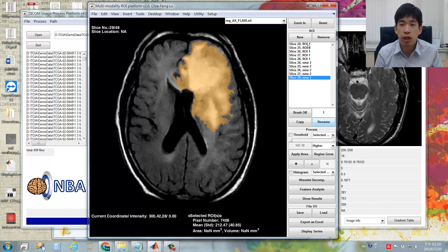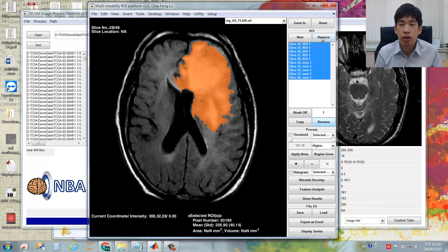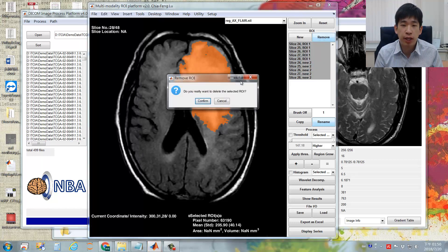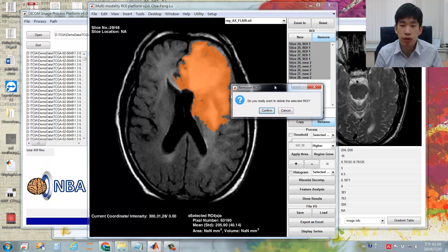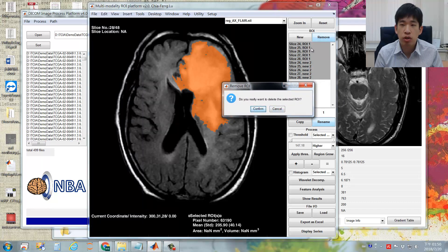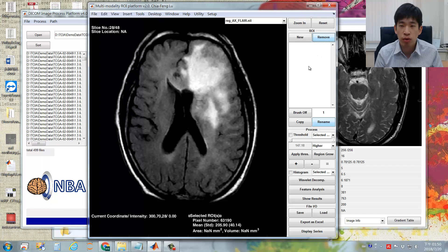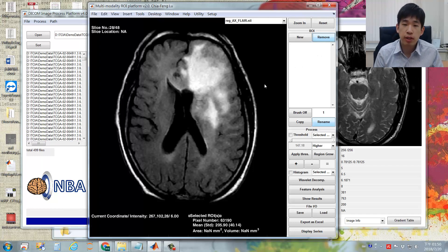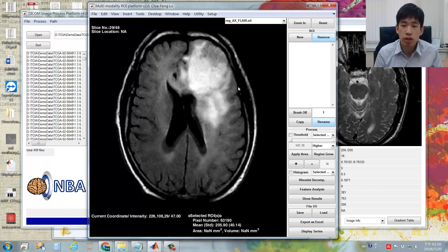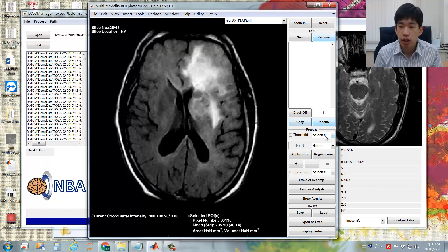You can also delete ROIs you don't want. Be aware that this step cannot be reversed, so use the Remove function very carefully. Now I click Confirm to remove all the ROIs. Producing ROIs slice by slice is very time-consuming, so there is another way using thresholding differently.